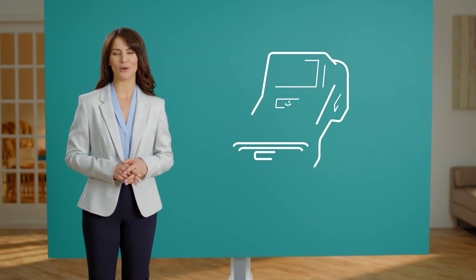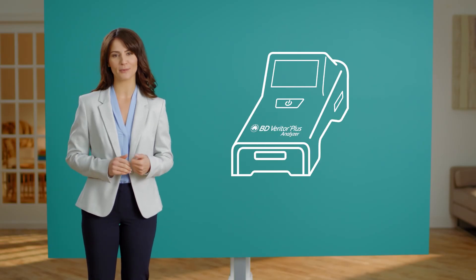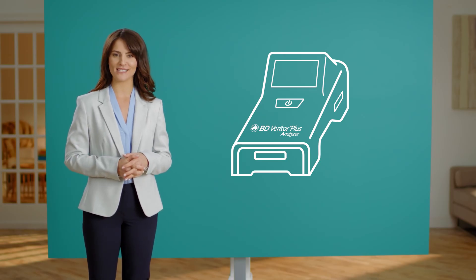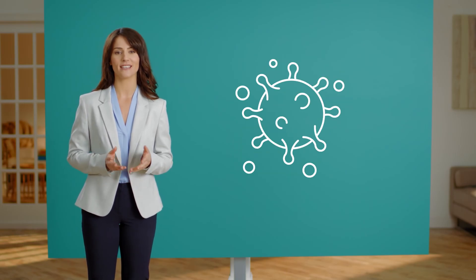A powerful tool for use in point-of-care testing, the BD Veritor Plus system is a portable device about the size of a cell phone that utilizes immunoassays to detect the presence or absence of a specific antigen. Detection of these antigens may indicate an infection.